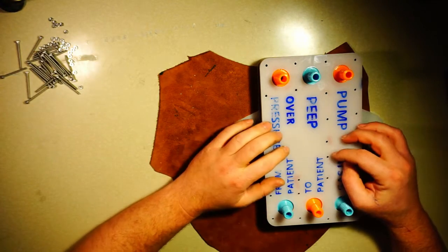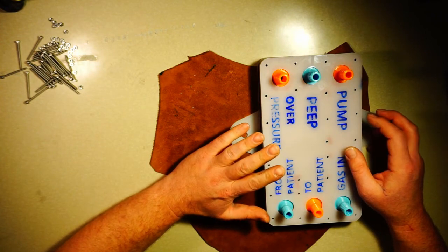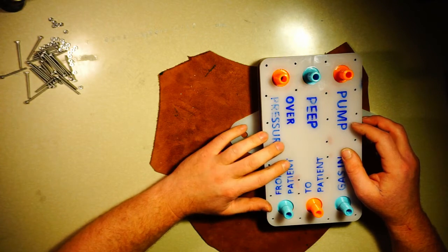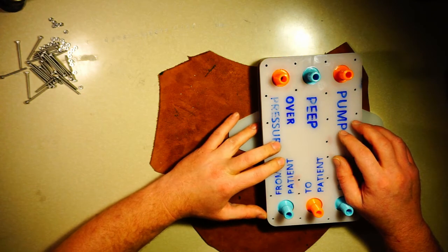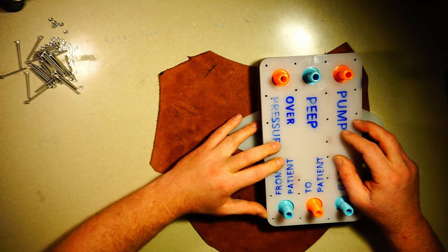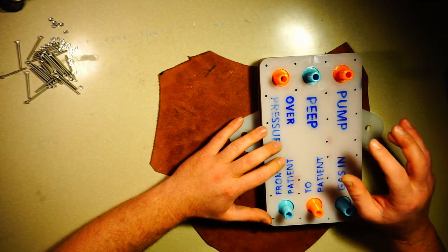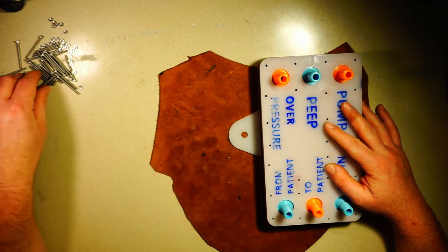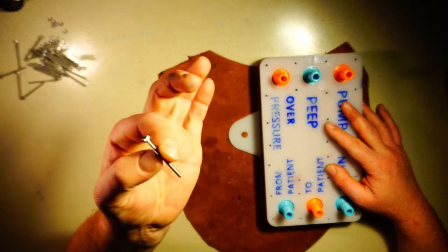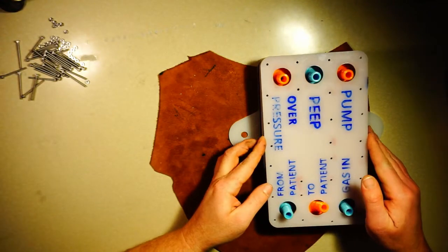These are all 3mm cut pieces of acrylic. Some are double layers to get 6mm because I did not have any 6mm in the scrap that I cut. However, you can certainly cut stacks of 3mm acrylic or single 6mm acrylic pieces. I will caution that if you use all 6mm acrylic pieces for this compound valve block, you will need some very long M3 hex screws, which you can come by, but they're a little bit harder to find than these, which are, I think, 50mm.